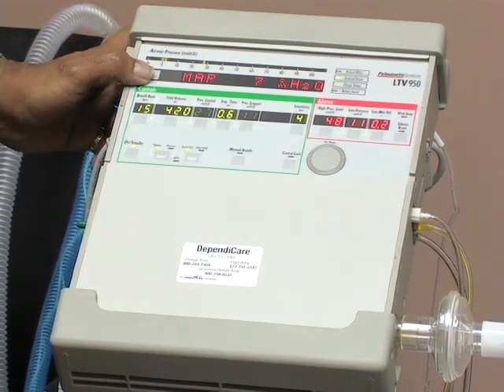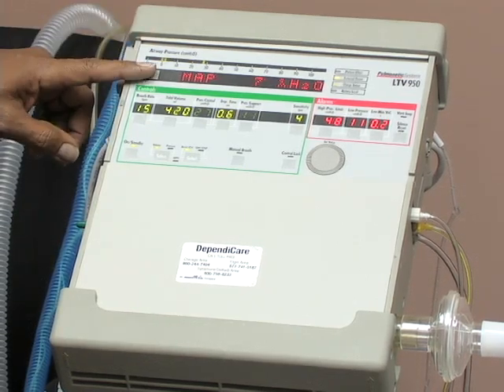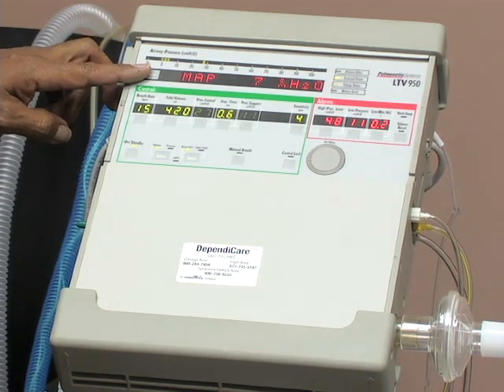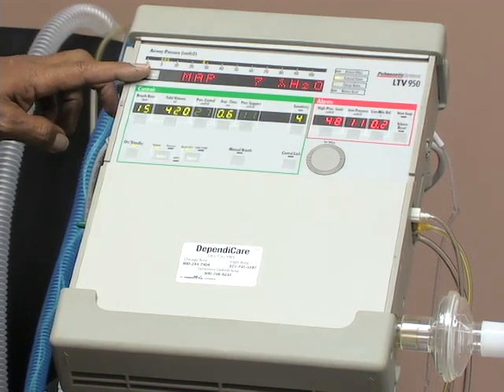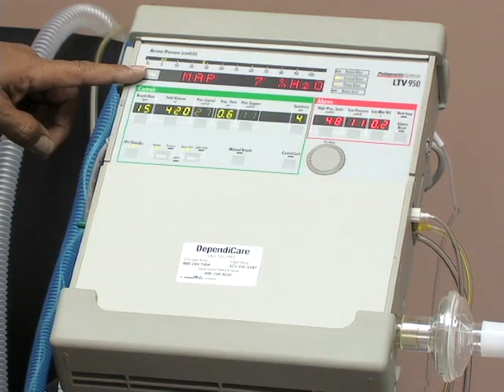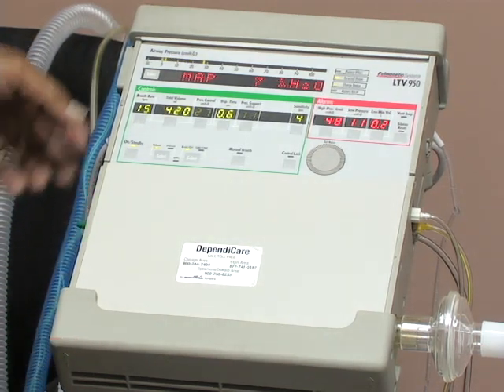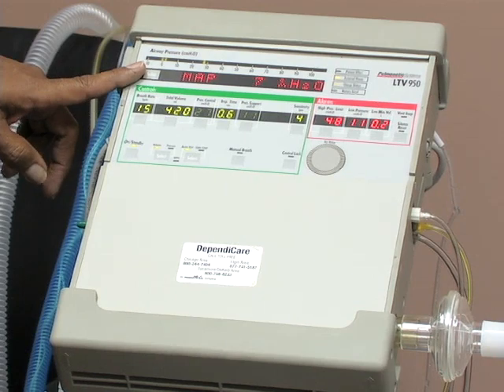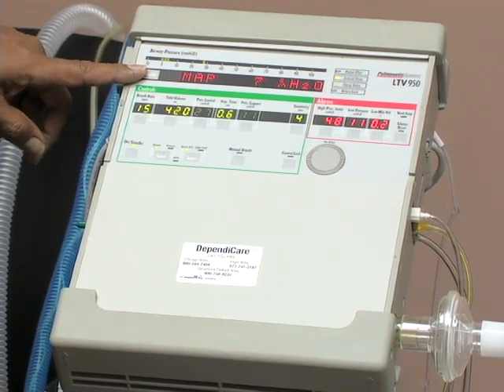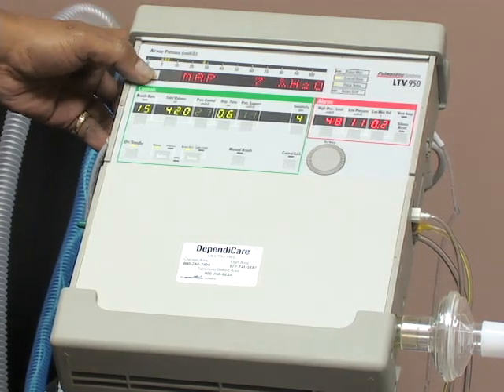So let's take a look at the MAP. Mean airway pressure. This is the amount of pressure that is in the circuitry and in your client's lungs, which is an average over the last 60 seconds. Think of your MAP akin to a diastolic pressure. It's more relevant to long-term indication of what's going on with your client, and is mostly used by pulmonologists and respiratory therapists, but it is a very useful reading.